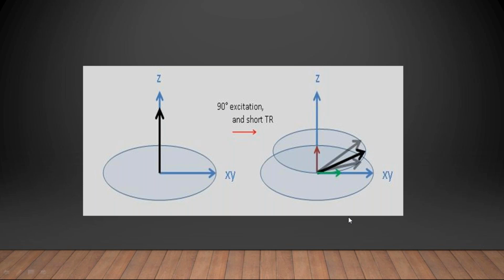Immediately after the radio frequency pulse is switched off, it will slowly convert again into longitudinal magnetization. During this process, the radio frequency coils will obtain signals from the different kinds of tissues in the patient, having a long T1 and long T2, and we will explain this later.